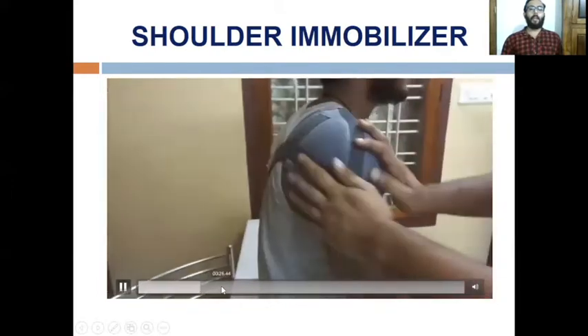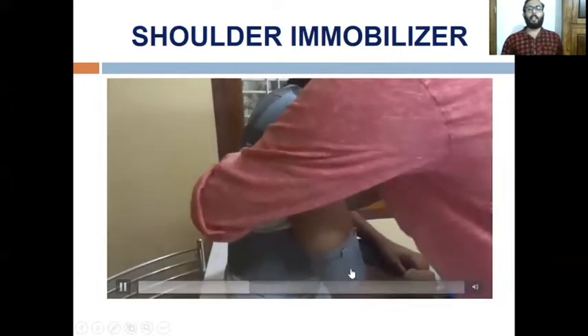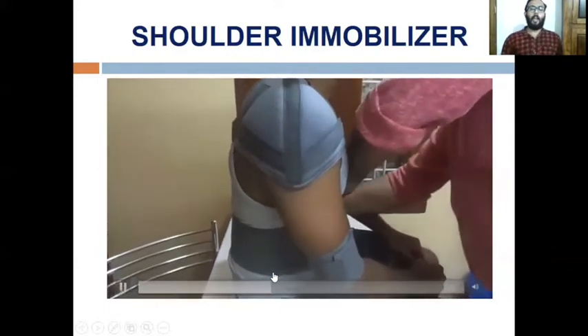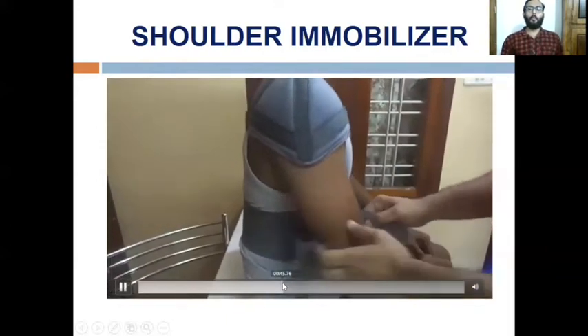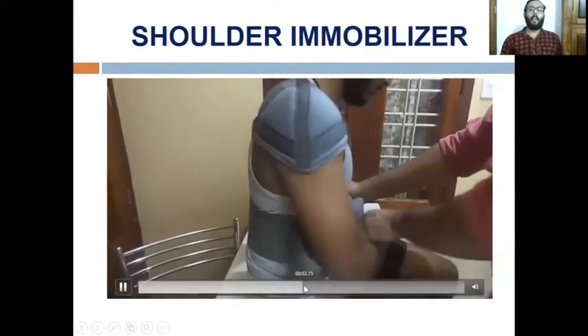In the shoulder immobilizer, one part is applied to the affected shoulder and the velcro is tightened securely. The second part is applied around the chest, with one strap at the distal end of the arm and another at the distal end of the forearm. With this immobilization, the patient's arm is completely immobilized so the patient is not able to move the arm, giving proper rest, compression, and protection to the affected joint.